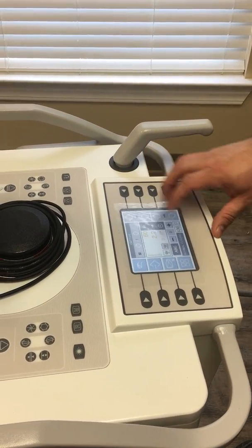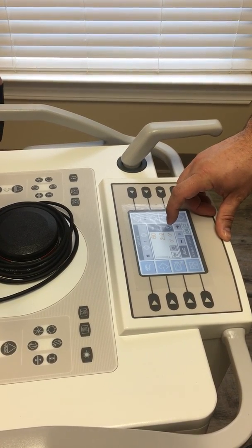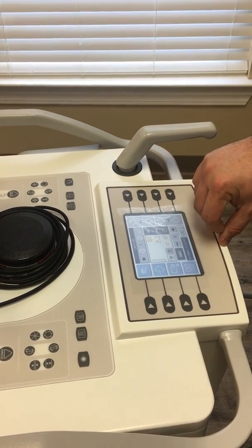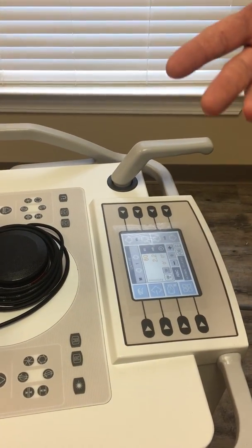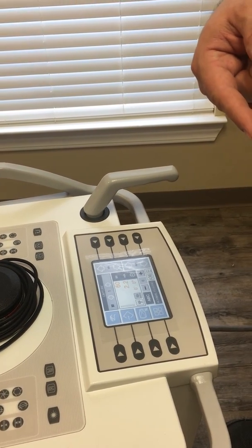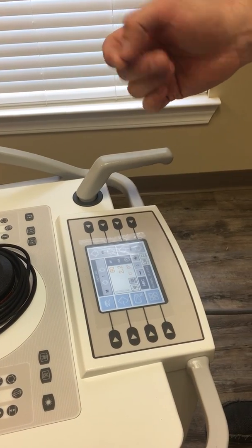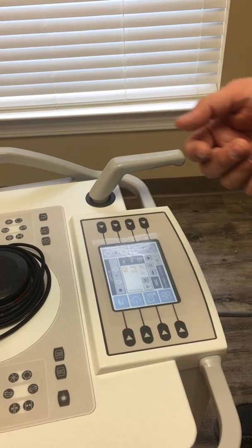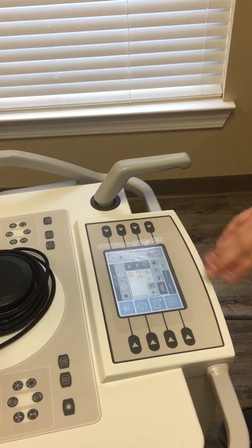One last thing on here. This picture of a clock is not just a picture, that's a fluoro timer reset. What's the time limit? It's 5 minutes. What'll typically happen is it'll do 5 minutes, and then it'll double beep. And when you hit 10 minutes, it'll alarm and tell you, hey, what are you doing? You've used 10 minutes here. But then you can just reset it, and it'll go back to 0, so it starts over.